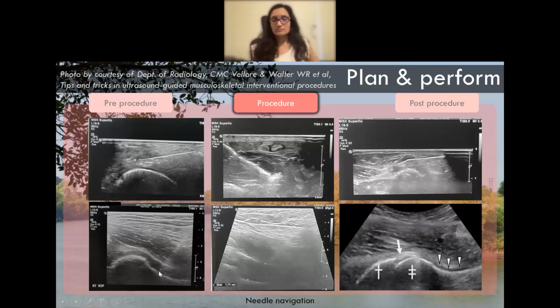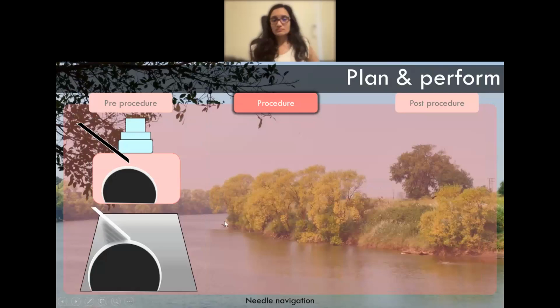And as we use the spinal needle into the anterior recess, we are not able to see the needle very well, as we have seen in the previous cases. And here, though we have used the 12 megahertz frequency probe, we are not able to see this. In such cases, what we can do, we can use the curvilinear probe.